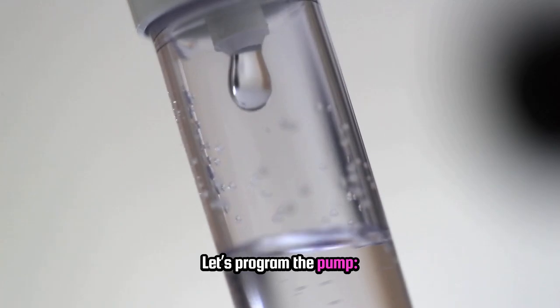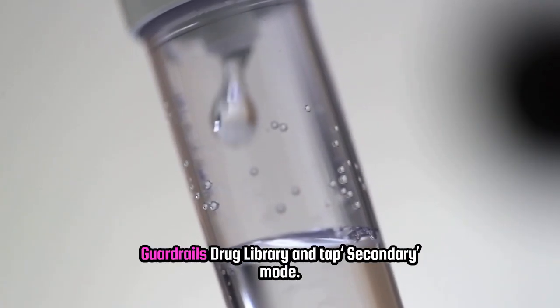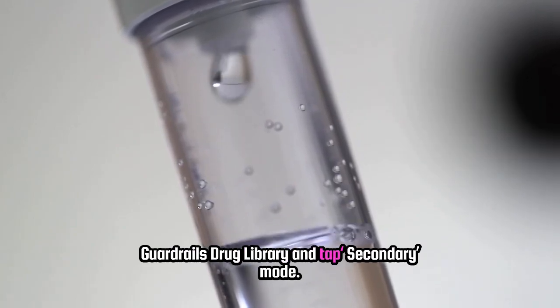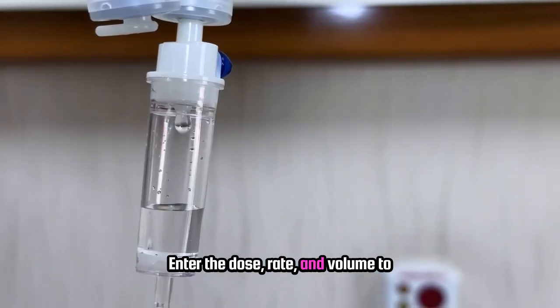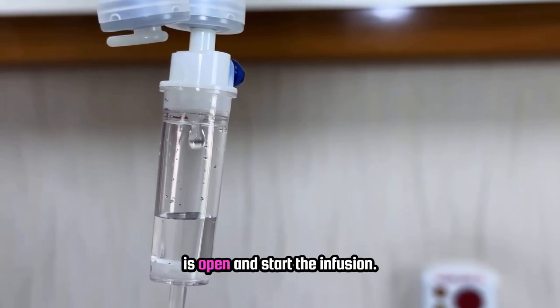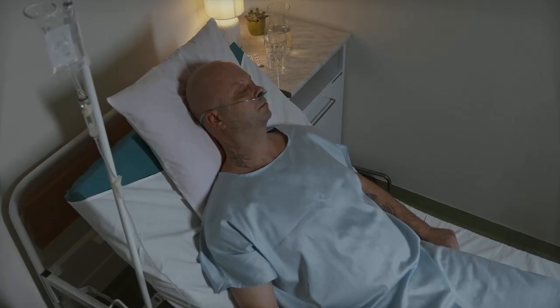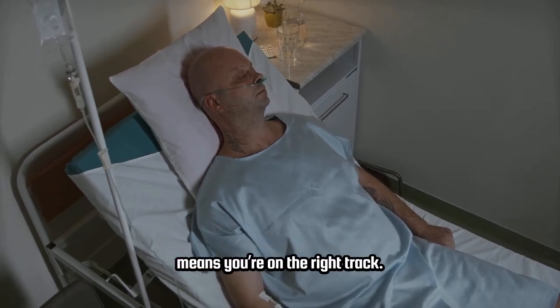Let's program the pump. On the Alaris 8100, choose the drug from the guardrails drug library and tap secondary mode. Enter the dose, rate, and volume to be infused. Then confirm your secondary clamp is open and start the infusion. You'll see 'secondary running' displayed, which means you're on the right track.